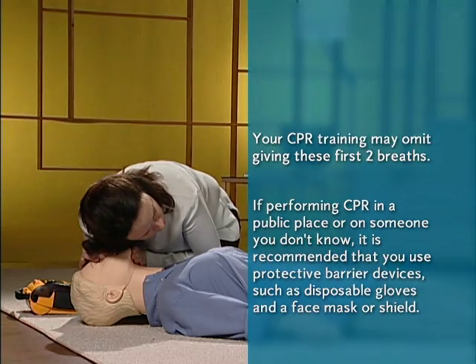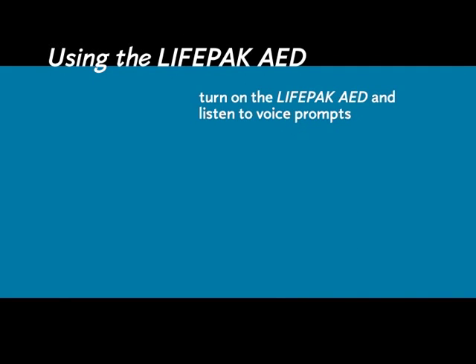Now it's time to use your AED. Using the LifePAK AED is easy. I'll give you a quick overview, and then we'll go through it again. Turn on the LifePAK AED and listen carefully to the voice from the device. It tells you what to do.